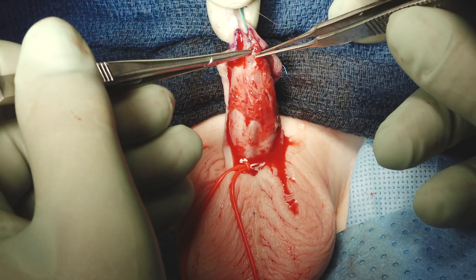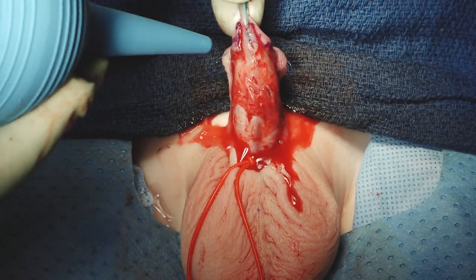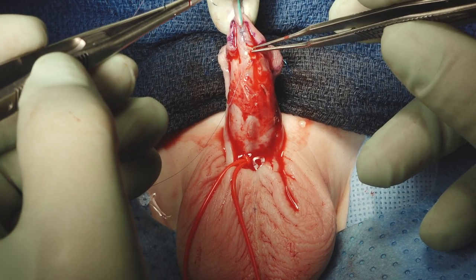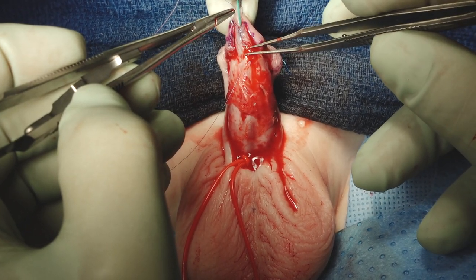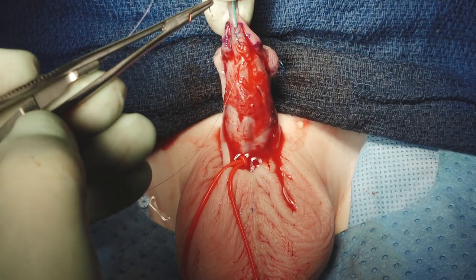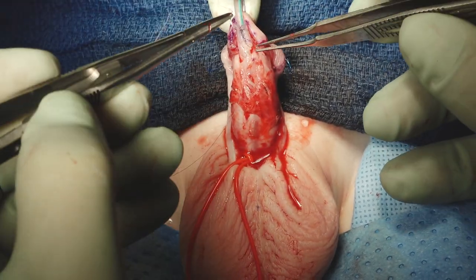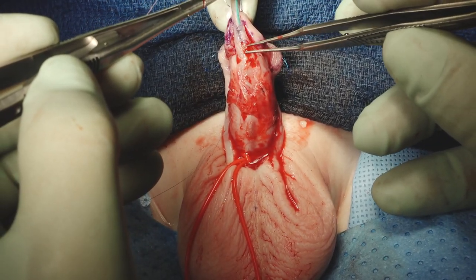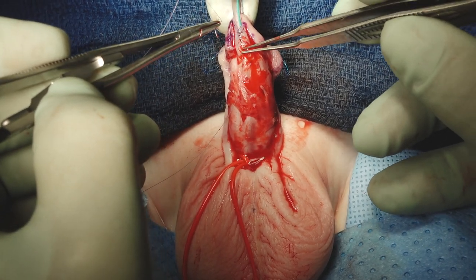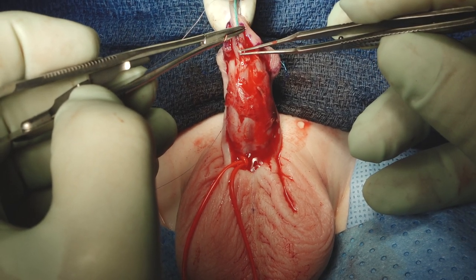It's funny — we haven't changed the TIP technique in terms of key steps: where to do the glans dissection, how deeply to cut the plate — since the technique was developed a quarter century ago. But minor things like our skin incision and how we test the urethroplasty have changed, so it's fun to keep you updated on that.